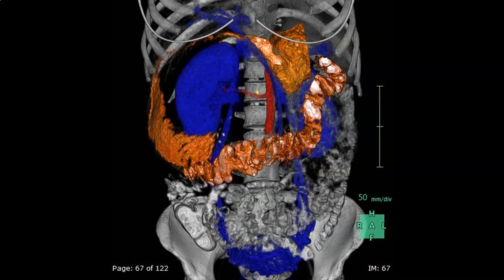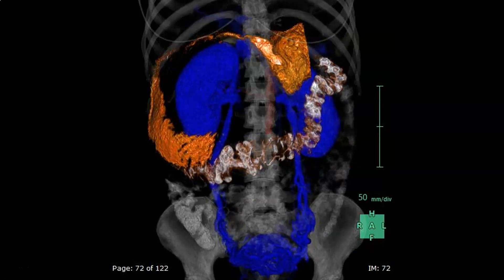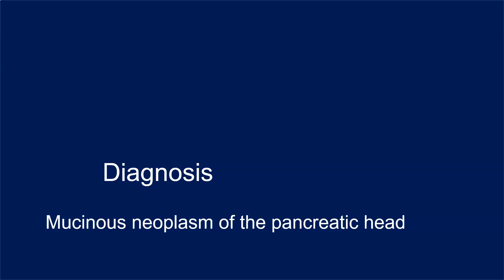The question is how the left kidney is drained. The answer is it is drained by retrograde flow of blood from the left renal vein via the left ovarian vein, and from there through the rich collateral network of veins inside the uterus, to the right ovarian vein and from there to the inferior vena cava. The diagnosis is mucinous neoplasm of the pancreatic head, proved by histopathology after a Whipple's procedure.